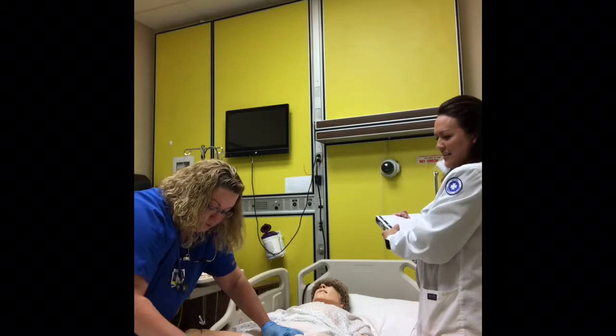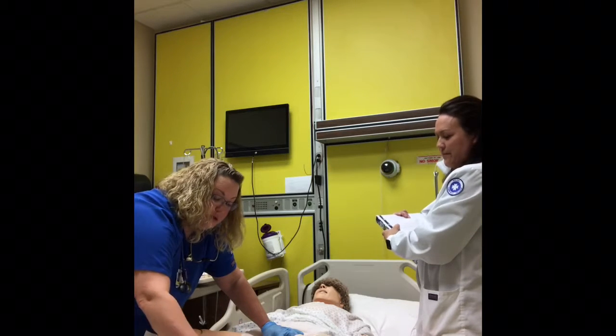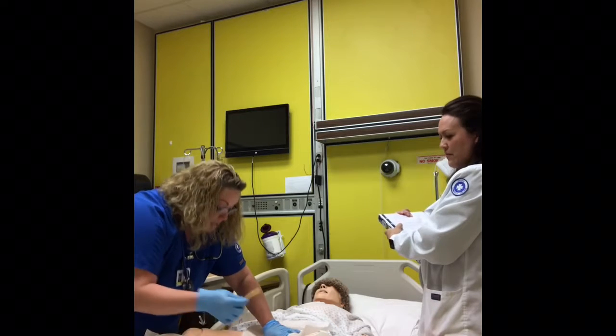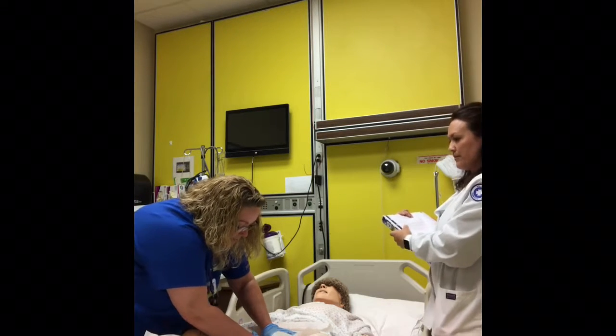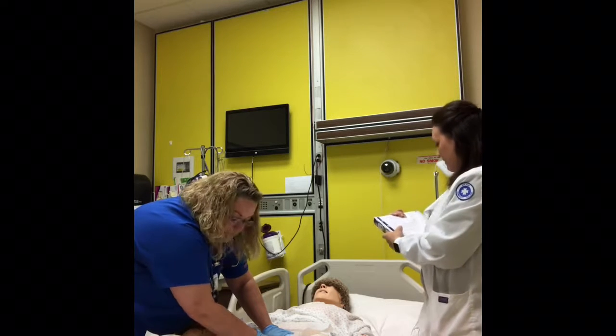Okay, dip in the lube. I'll take that off when I take the lube off. Dip it in the lube very generously. Then you're going to take this and advance it into the patient, and you're going to advance this into the patient all the way until you see urine return.